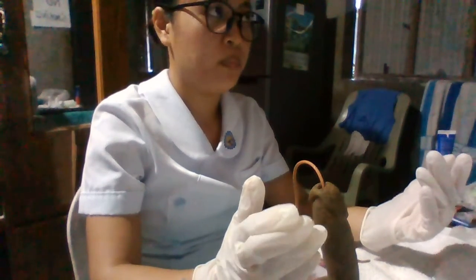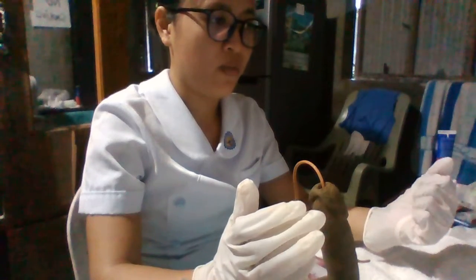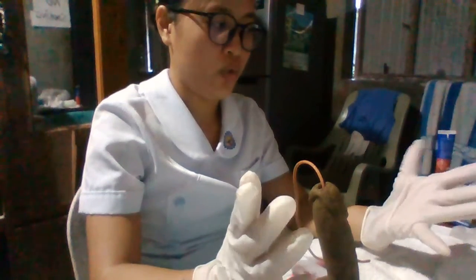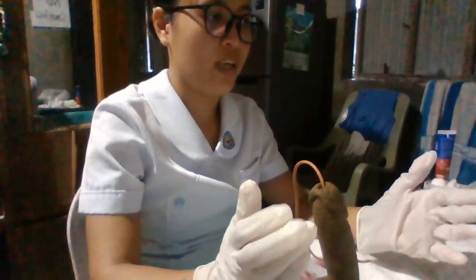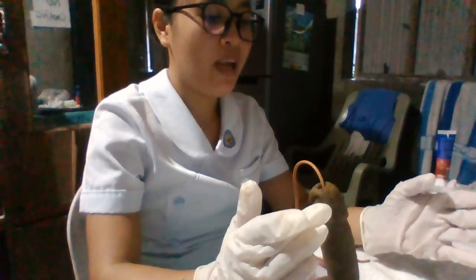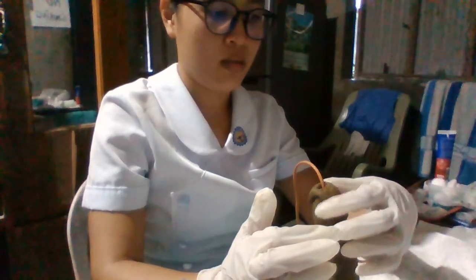The position of the non-dominant hand should be maintained throughout the procedure. Then for a male client, we're going to retract the foreskin.